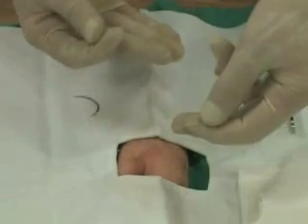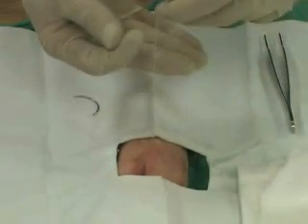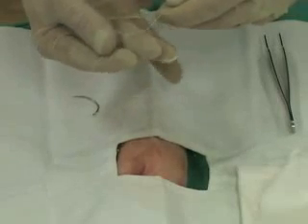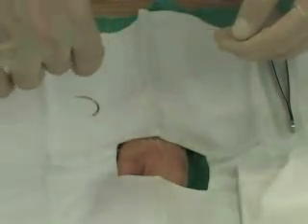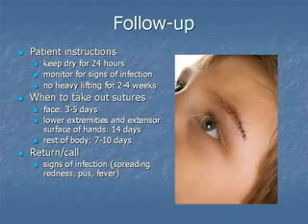For the second half of the one-handed tie, pinch between the thumb and the forefinger with the short end, pull the long end over the third finger, bend, grasp the short end with the third and fourth digit, pull through the loop, and line out flat. Follow-up instructions are important once the suture is placed.